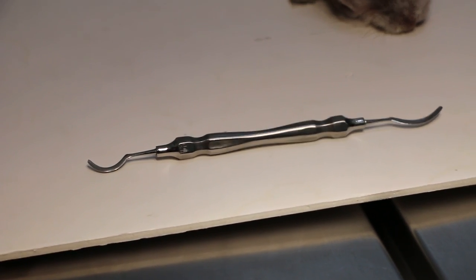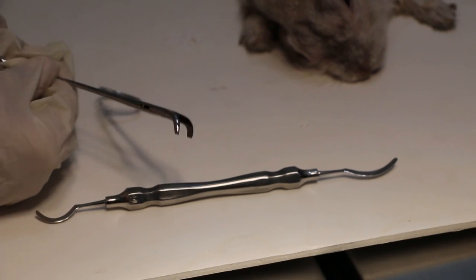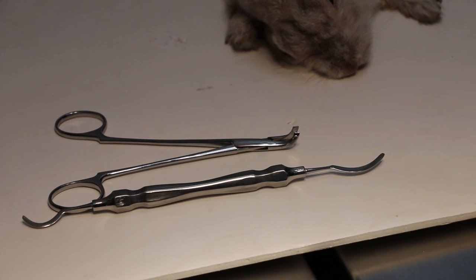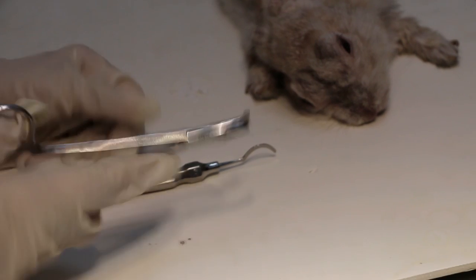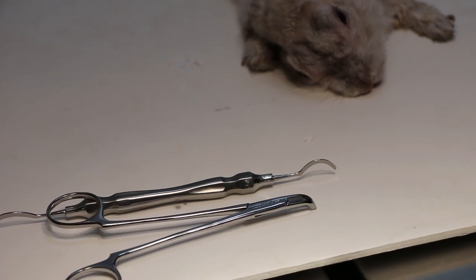This instrument grips the loosened tooth — it could be a molar or the front incisor. Upwards will be for the upper tooth; downwards for the lower tooth. The tongue and pouch spatula depresses the tongue. The molar luxator is for the back cheek teeth — it's specially made for rabbit and rodent dentistry, with different angles for upper and lower molars.